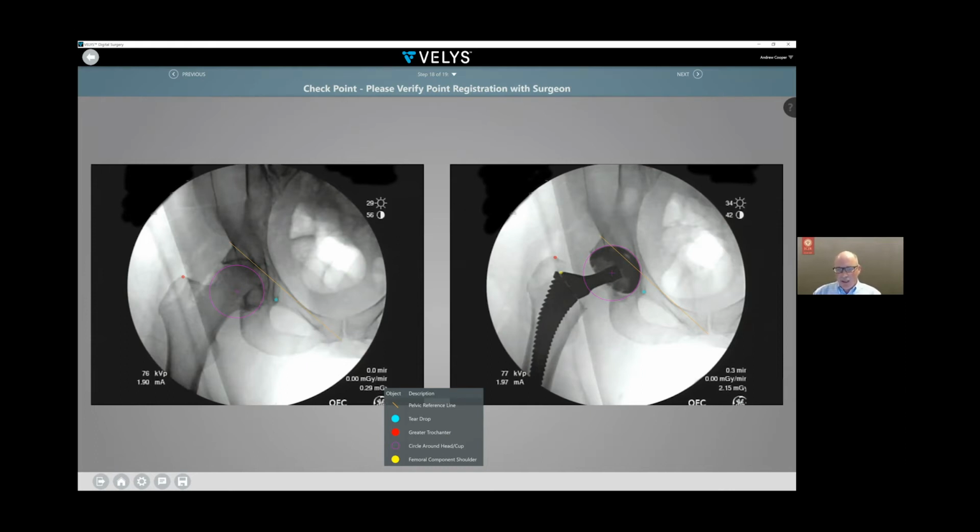I'm about to get my acetabular exposure, and in the back side of the case, usually a representative or a nurse can mark these points. I don't know they're happening because I'm in the OR and I'm operating. And then I put my cup in, and when I put my cup in, I can show you that in a second.